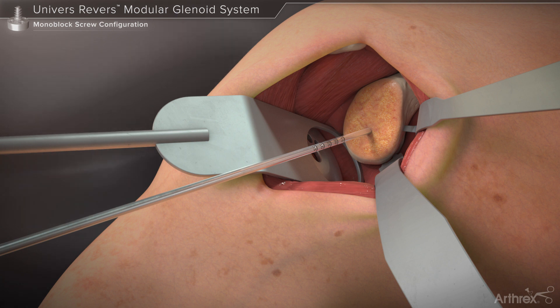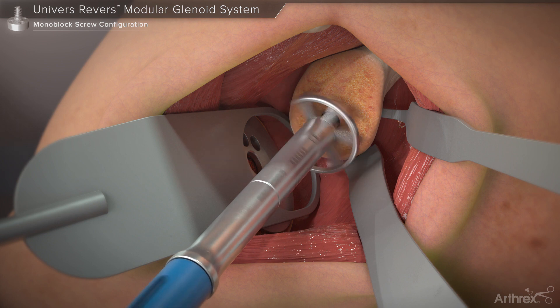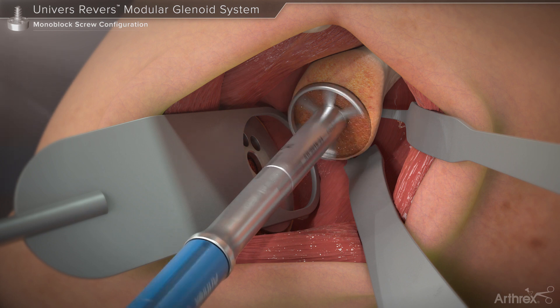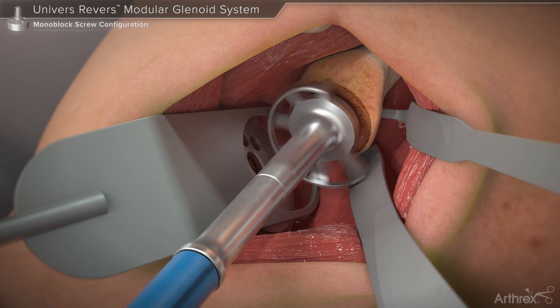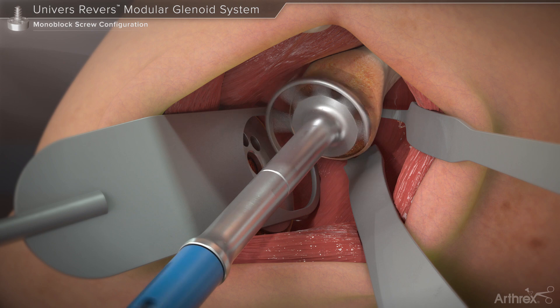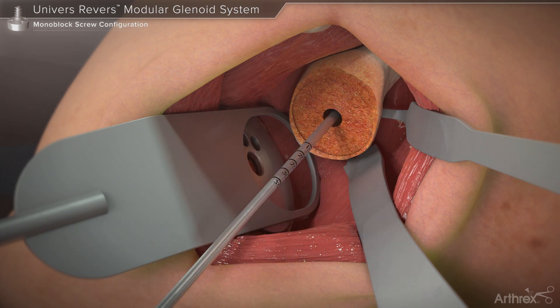The primary reamer corresponding to the base plate diameter is introduced over the guide pin. Reaming should be continued until conformity between the reamer face and glenoid surface is achieved. Next, the peripheral reamer is used, which corresponds to the size of the desired glenosphere. This reamer has a positive stop and will clear tissue to allow for glenosphere seating.